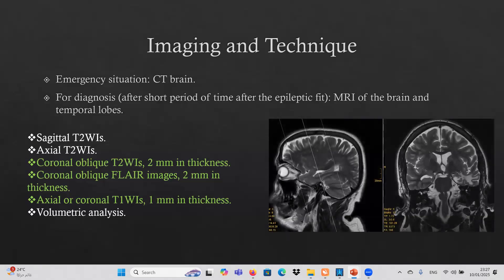Regarding the coronal oblique T2 or FLAIR image, this is the standard for imaging of the temporal lobes.